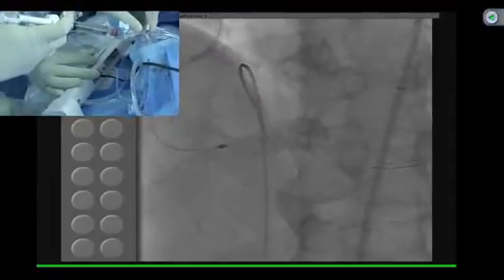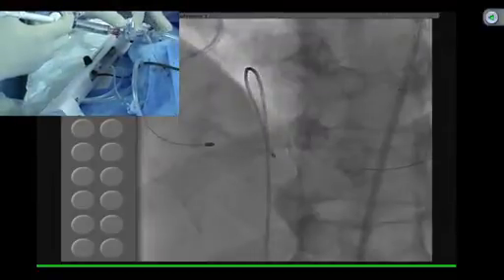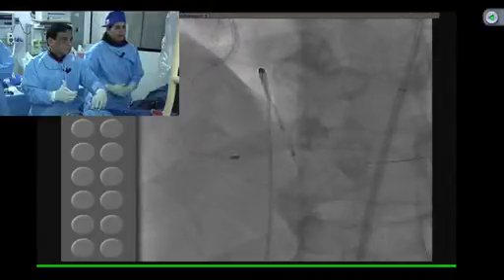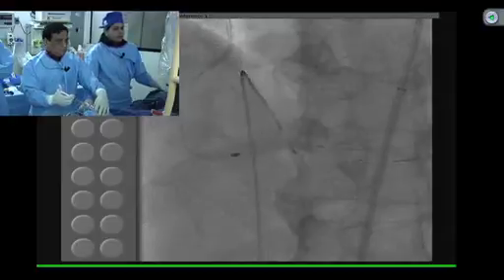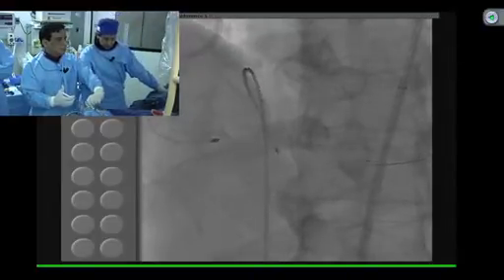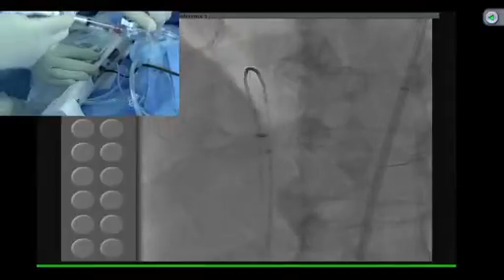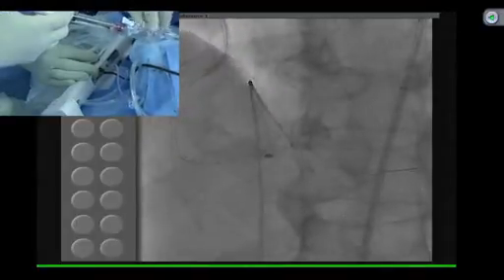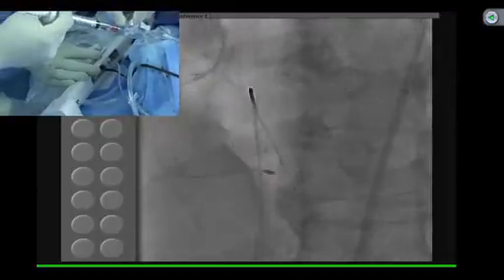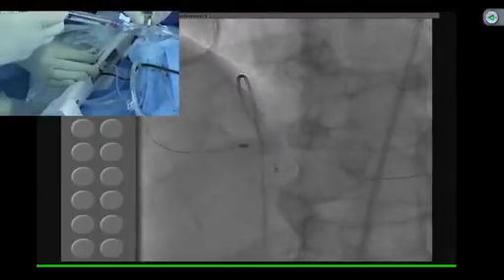They said 20 seconds, so just pull back and wait. For some reason the patient, even when you give atropine, is pacemaker dependent as soon as we do the rotational atherectomy. Maybe a little bit more. Go. We try one more pass. It is still giving us a hard time. We may have to downgrade. Downsize to 1.5.